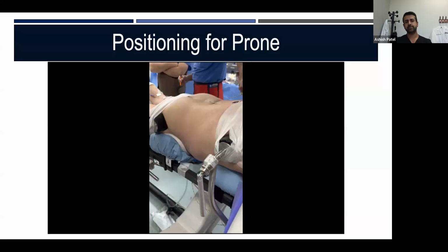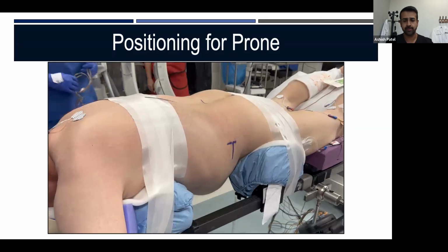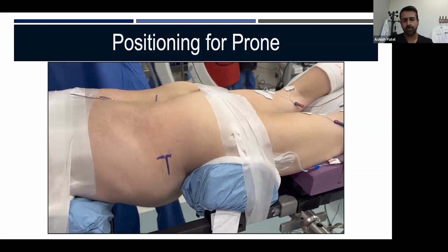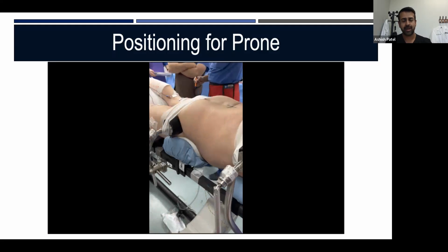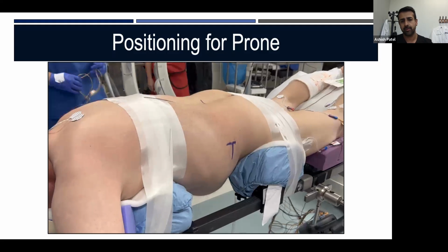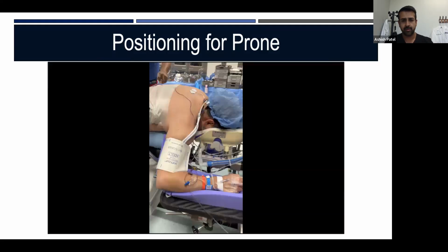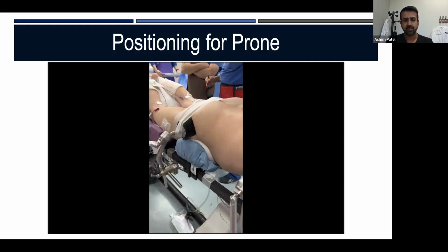And so we started by constructing a crude apparatus where we use orthopedic bolsters and tape. What we're really trying to do is recreate the contralateral bolstering effect of the table that we don't have anymore. You can see it's traditional prone position, and the orthopedic bolsters on the contralateral side provide us a little bit of resistance.